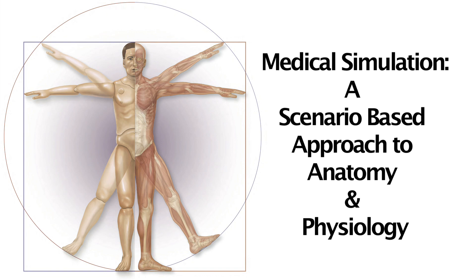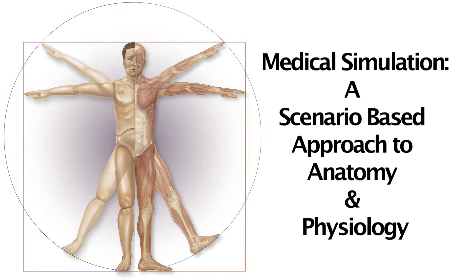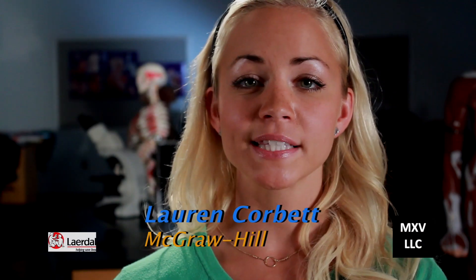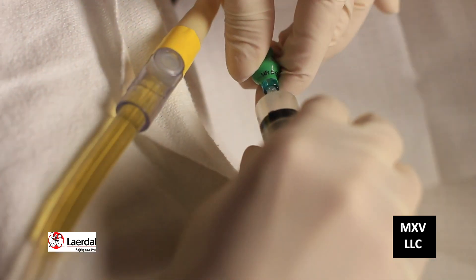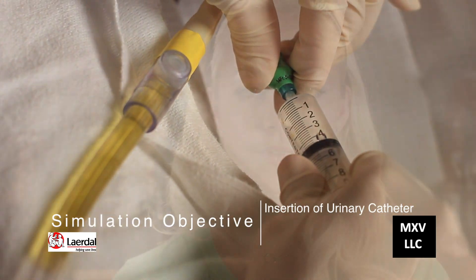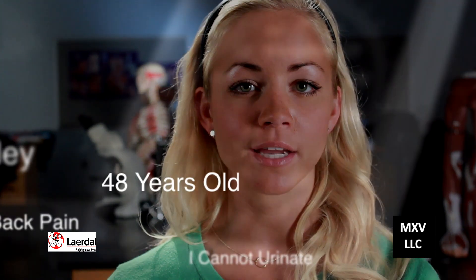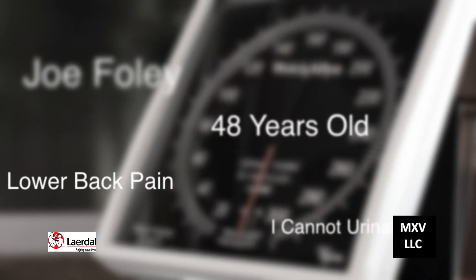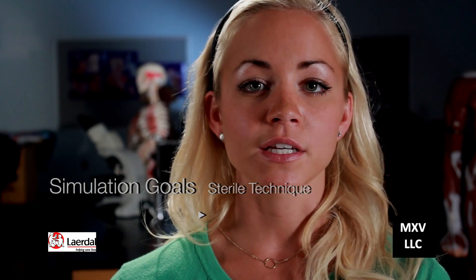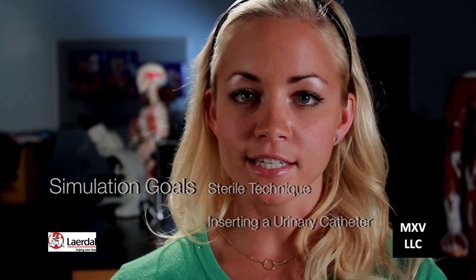Welcome to the video supplement for McGraw-Hill's Medical Simulation. In this week's scenario, 'I cannot pee,' your objective will be to insert a urinary catheter into our patient, Joe Foley, who is 48 years old and has lower back pain and cannot urinate. Your simulation goal involves using a sterile technique and inserting a urinary catheter.